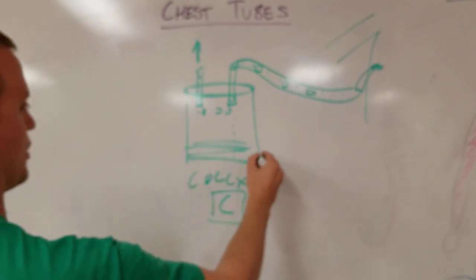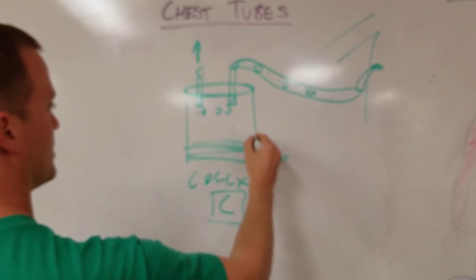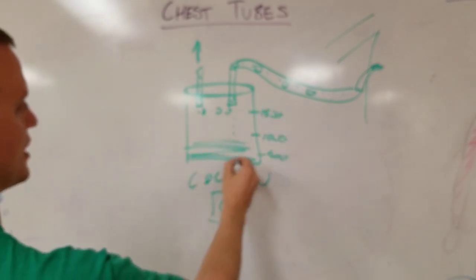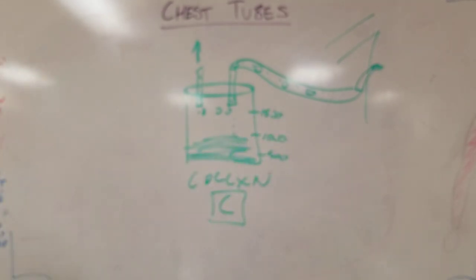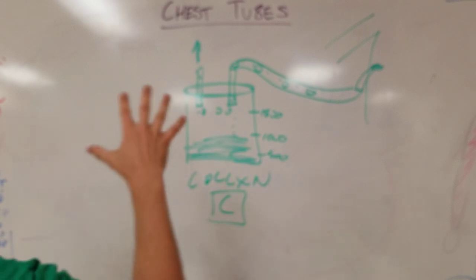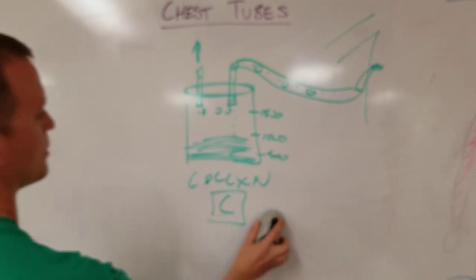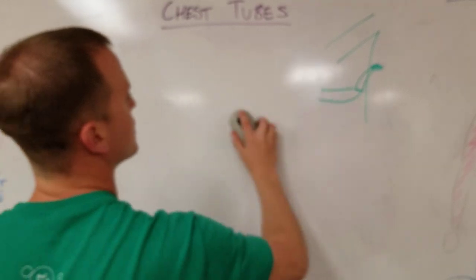So this glass jar would have some nice volumetric markings on the side of it. And then over time, you could say, hey, this guy's put out 1,000 cc's of serosanguineous fluid or frank blood or pus or what have you. And that's the whole purpose of this first container, okay? It's just for collection. Remember that? I'm gonna redraw this so I don't use up all my space.